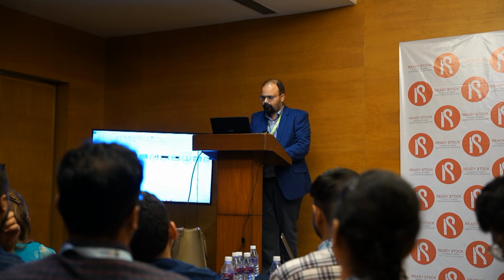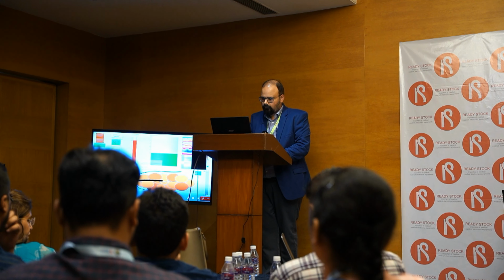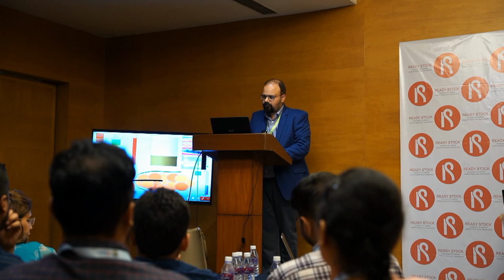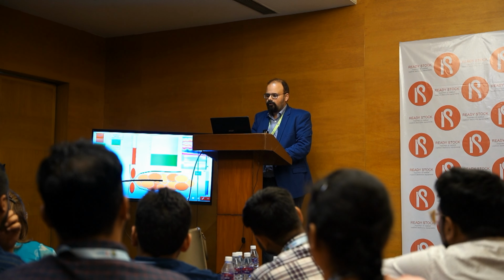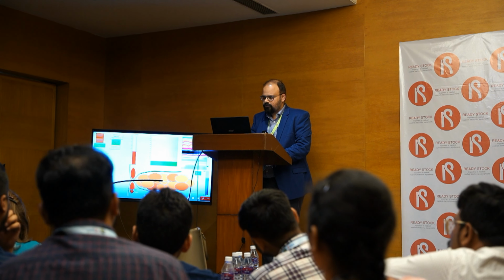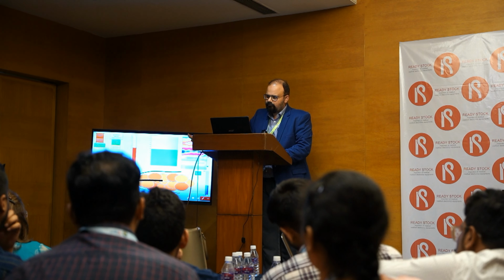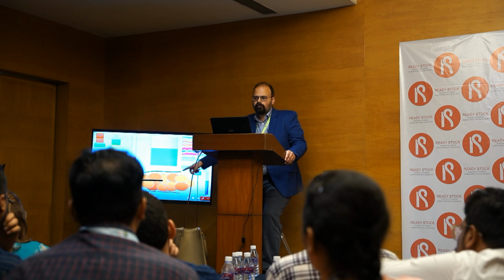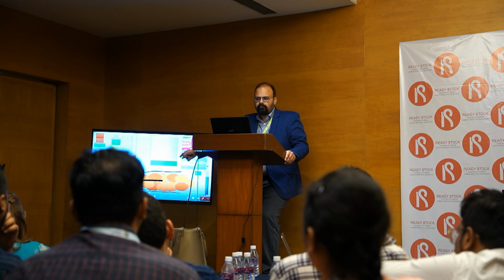in the first session. Then I think the last part would be our push training. Yeah, so this is the push. So you have the rectal pressures now, you have the anal canal pressures now, something similar, and you have a live recording. Here you ask the patient to exert. She will start exerting now. This is, I think, the 5th or 4th session of this particular patient. So you can see the anal canal has now started to relax a bit.